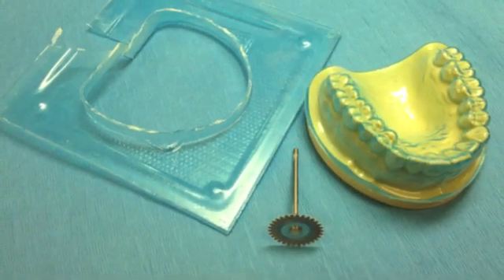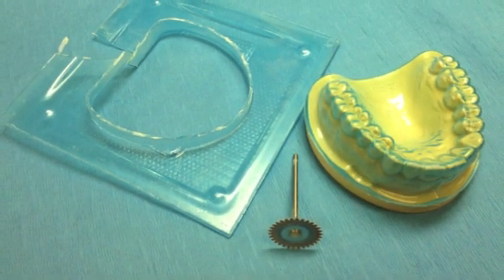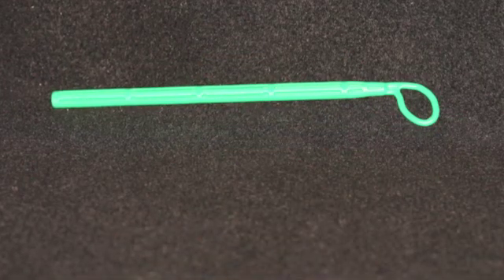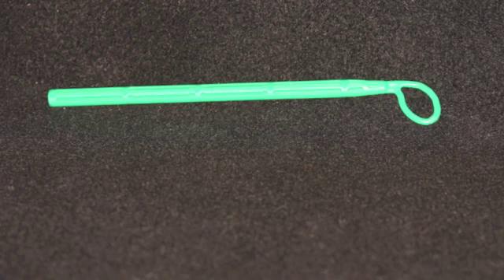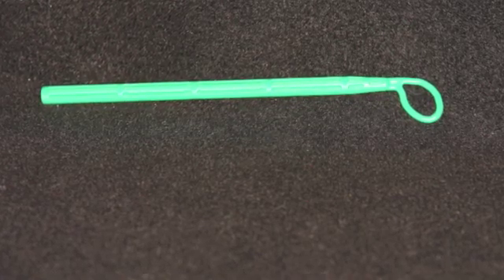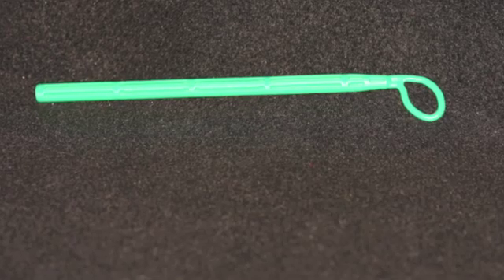Cut away the excess stint material at the edges of the vestibule so it can be remounted. Use the green occlusal ring behind the molars and reset the incisal guide pin. Note, it is likely to be 3 to 5 millimeters above your reference mark.